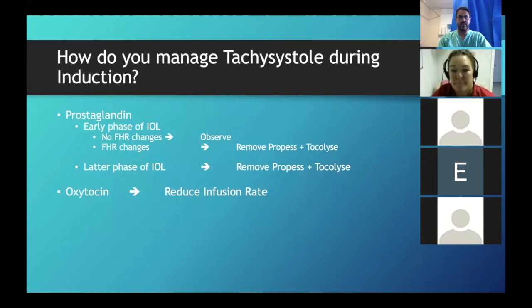Okay, you need to start thinking about, okay, do I have risk factors for sepsis? Do I think that this is sepsis ongoing? Or why did this baseline go up? Babies do not raise their heart rate for no reason.